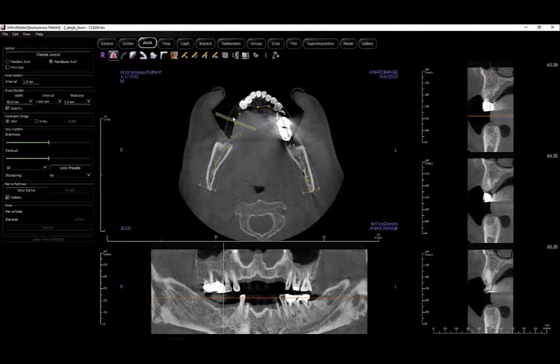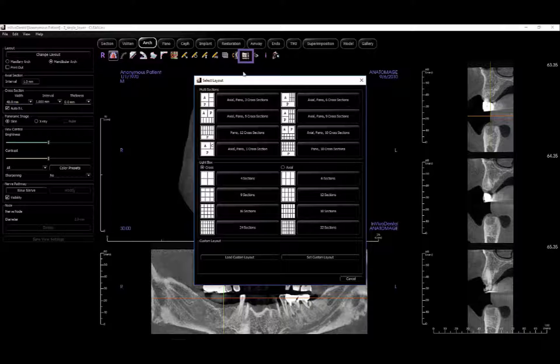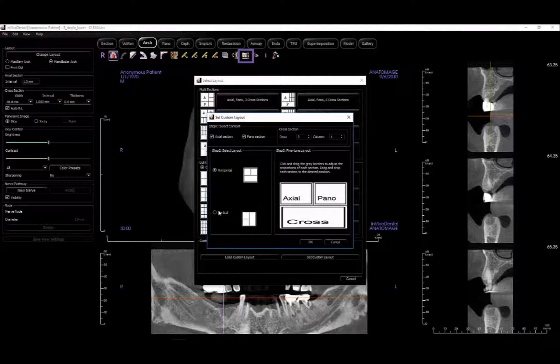This layout can be configured using the layout tool, including a new custom layout tool that provides complete design control to the user.